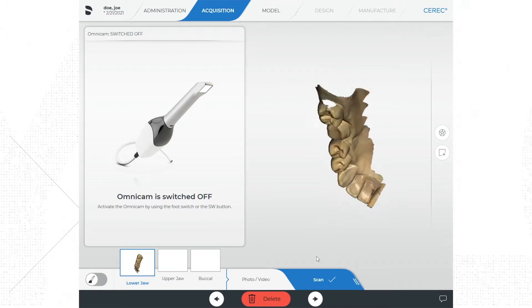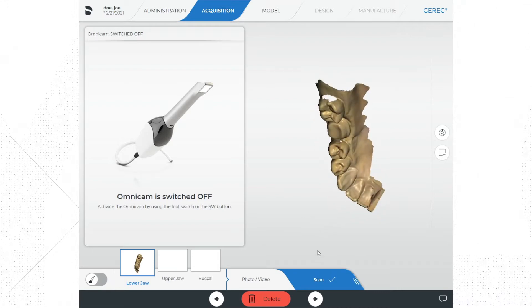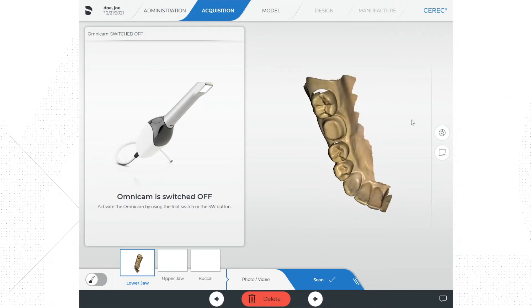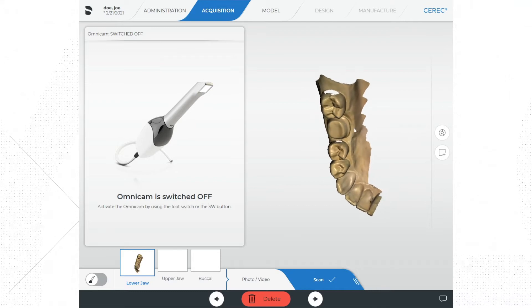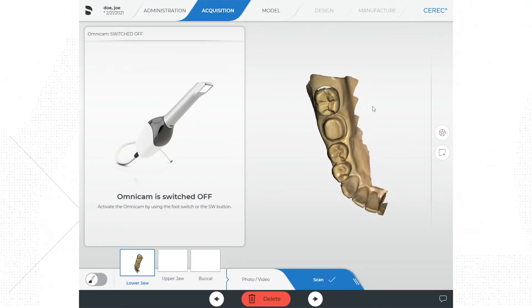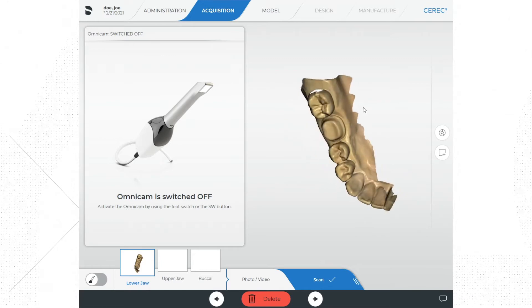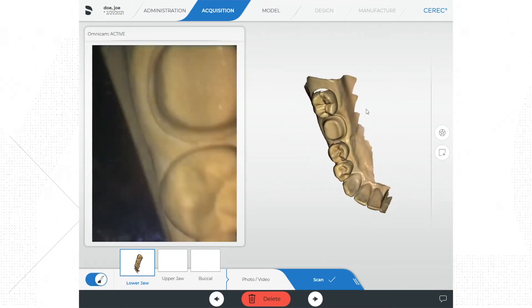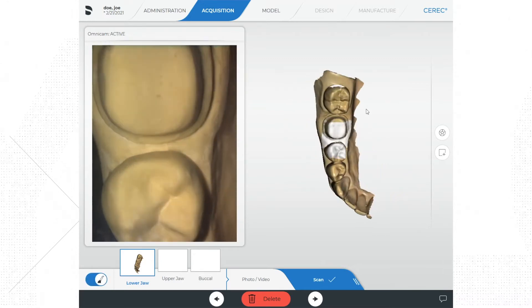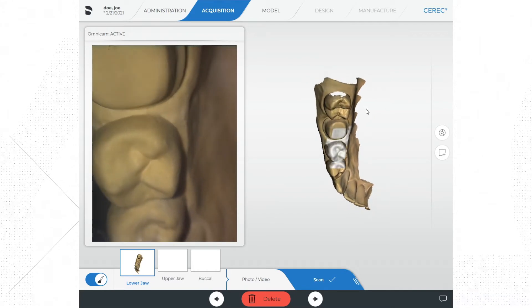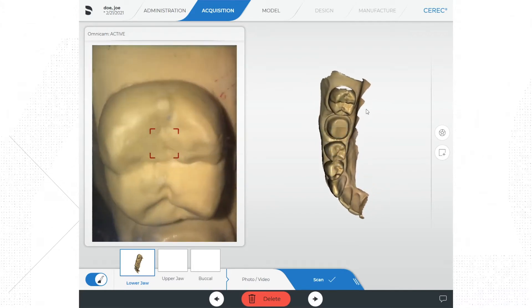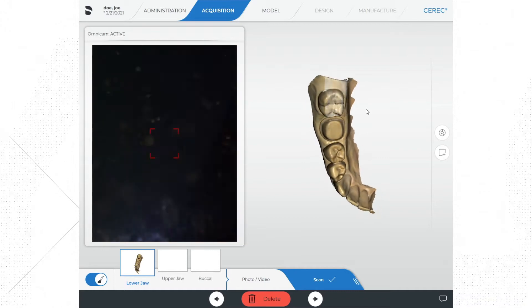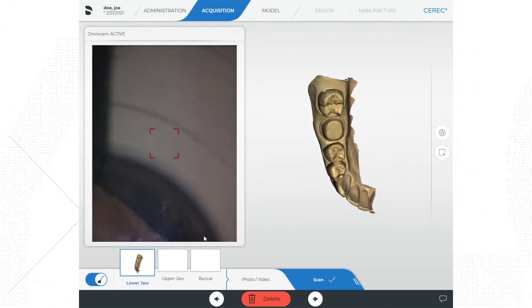Once I think I have my arch scanned, I can turn off the camera and take a look at the digital model. Take a good look and see if you notice any voids. When I scan these models I often notice a void where I have no data on the proximal view of the adjacent teeth. If you see a void, simply turn the camera back on and try to recapture that voided area using different camera angulations.